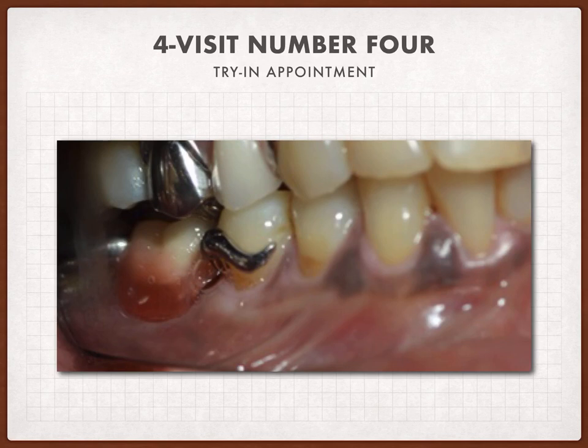When the patient says the number 15, the upper teeth must contact the wet-dry line of the lower lip, and if the teeth do not touch that, but instead touch the area anterior or posterior to it, that means there is some problem and we should rearrange the teeth so that we will have better phonetics and aesthetics together.